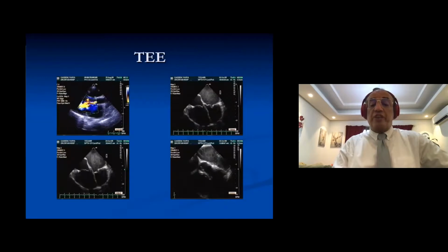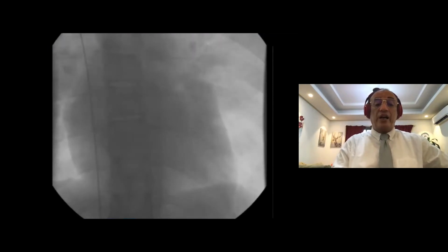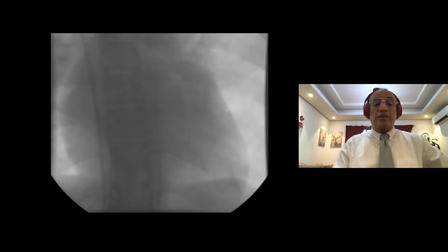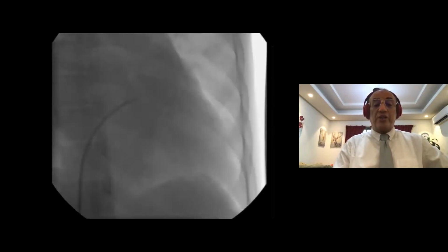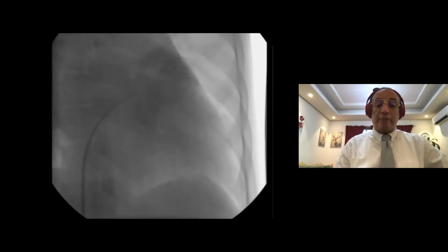Transesophageal echo shows a heavy smoky shadow, no left atrial thrombi, and you can appreciate moderate mitral regurgitation and moderate aortic regurgitation, which explains why the left ventricle is a little bit dilated. Again, the guide wire is in the IVC, right atrium, SVC, then the Mullins dilator in the SVC, then after septal puncture, contrast in the left atrial appendage.